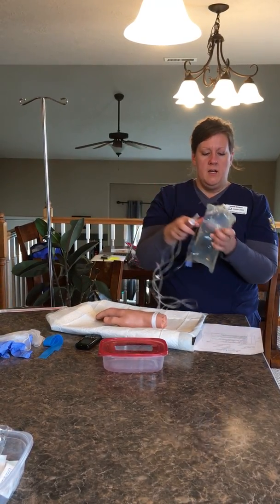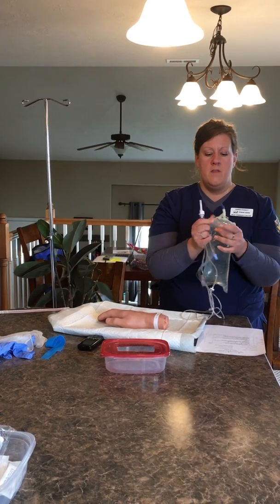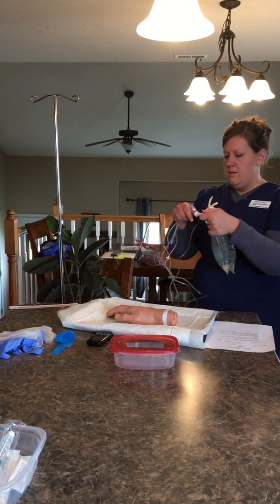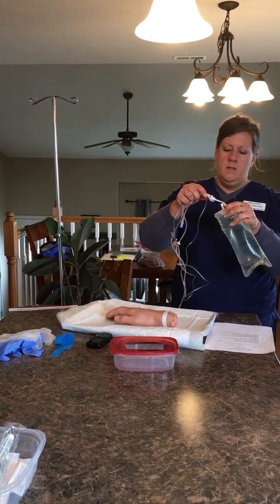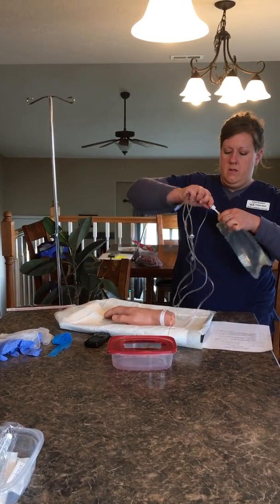Then to spike, when I pull off the tab from both of them, I'm going to make sure that I don't contaminate them by touching anything. If I do, I would have to start over with new supplies.